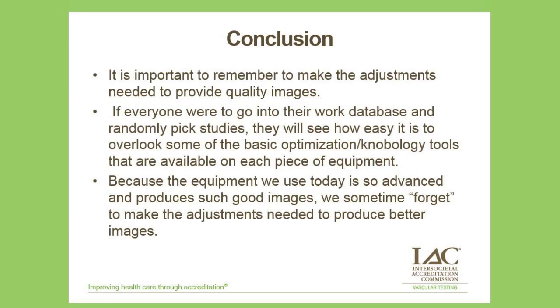If we were all to just go look in our database or our PACS system where we store our imaging and randomly pull out some cases, you'll see that there's certain things that we could have done to just make the image that much better than just using our basic presets, taking the image and sending it through. Because the equipment we use today is so advanced and it produces such good images, we sometimes forget to make those minor adjustments we need to produce better images.